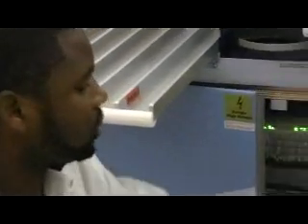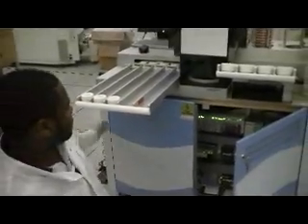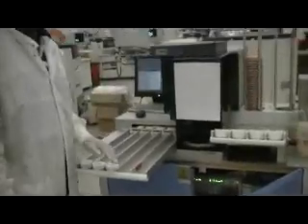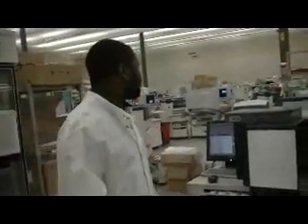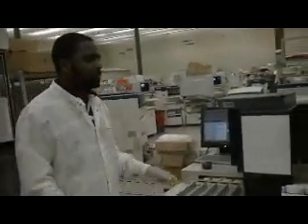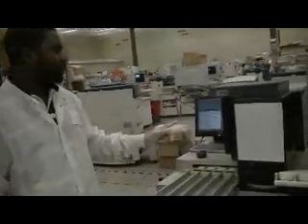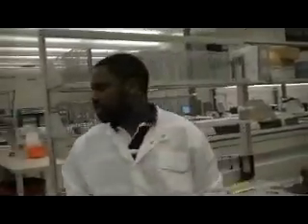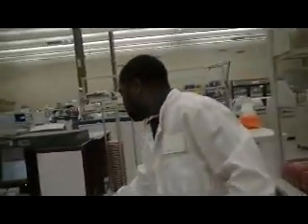Normally, when you turn on the machine, it will also run a diagnostic check on all these. If anything is not working, it will give you an error message on the screen. So your machine is ready to run a urine culture. I'll go ahead and run one and see if it is working fine.